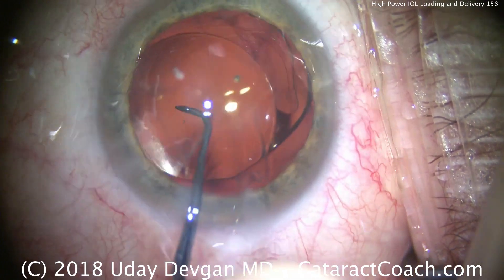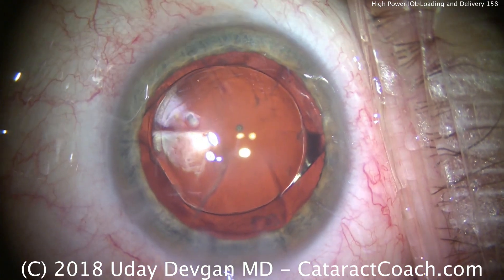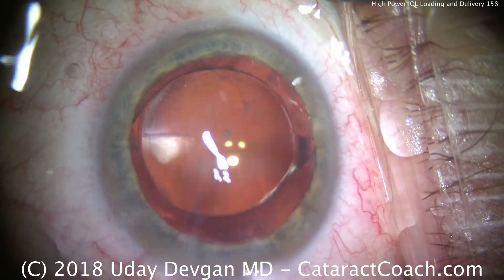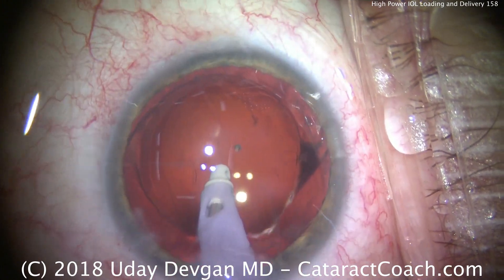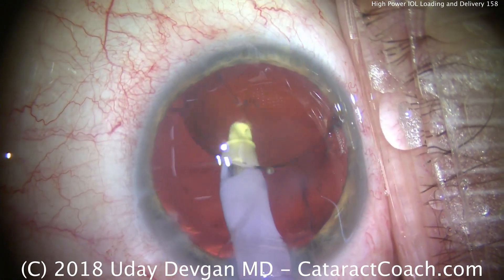The patient was wearing a plus 7 contact lens prior to this. That lens looks like it's in good position. It's important to remember that we want a special aspheric lens here — a lens that does not induce spherical aberration.